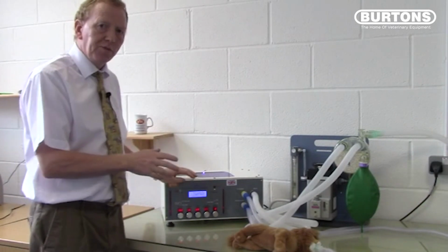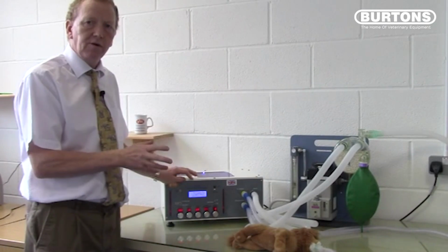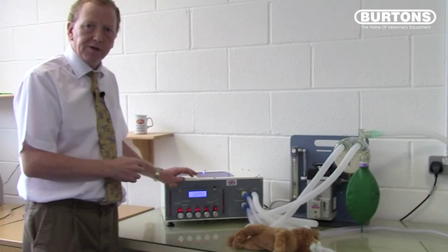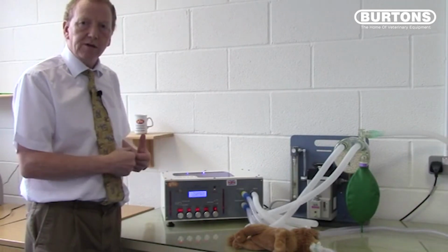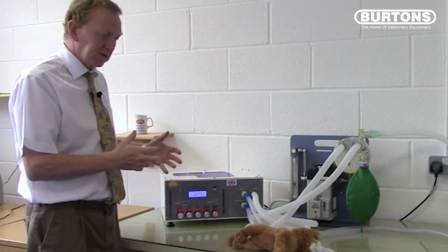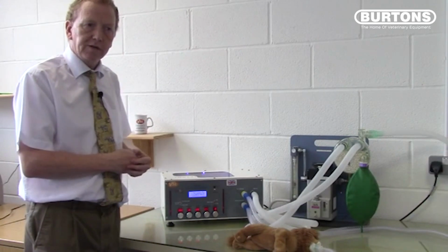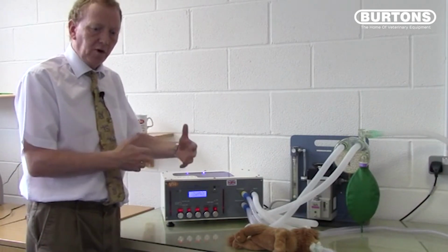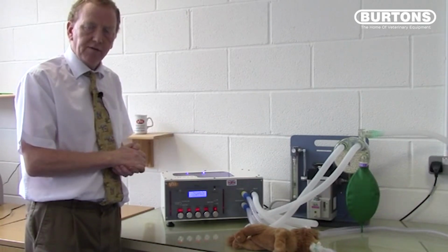In the previous video, we looked at volume cycling and saw how simple it was to apply simple maths to calculate a tidal volume for an animal and apply it to a patient and then adjust it for a target airway pressure. In a similar way, we can ventilate an animal with a target pressure rather than a target volume, and when we use a target pressure, this is called pressure cycling. In pressure cycling, we will deliver a constant flow until a certain predetermined pressure is reached. This is subtly different from volume cycling, where a volume is delivered until the whole volume has been delivered, irrespective of the pressure reached, unless we set a safety valve limit.